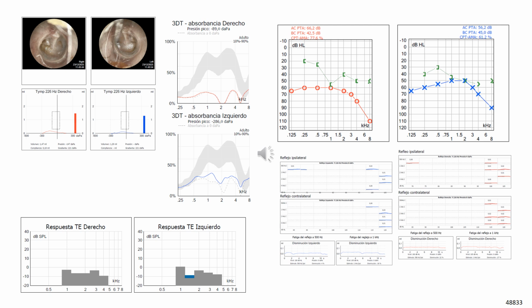Acoustic reflexes and OAEs are absent, as expected. The middle ear problem blocks sound transmission. Otoscopy shows a retracted tympanic membrane. Myringotomy confirmed the presence of fluid. All results together indicate bilateral otitis media with effusion, on top of a previous sensorineural hearing loss.